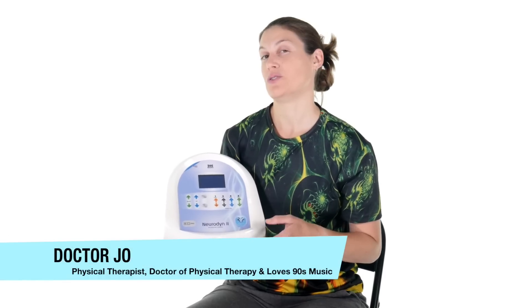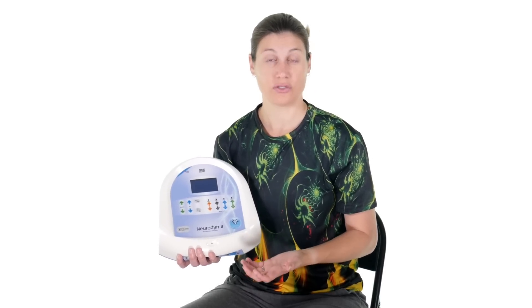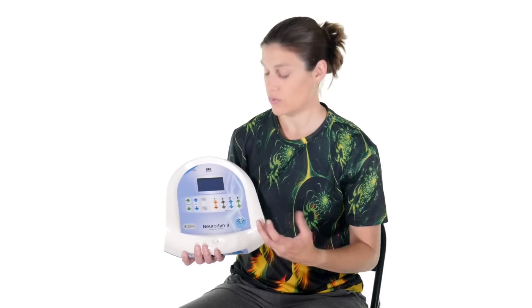What I really like about the Neurodyne 2 neuromuscular stimulator is it has three different settings. It's got the traditional TENS which is for pain relief. It has a Russian current which is really for muscle contraction, muscle retraining, and helping get that strength back. And it also has an FES — functional electrical stimulation — which really helps the muscle functionally. So if you have foot drop and you're trying to get dorsiflexion, you can use the FES to help pull it up while you're walking.